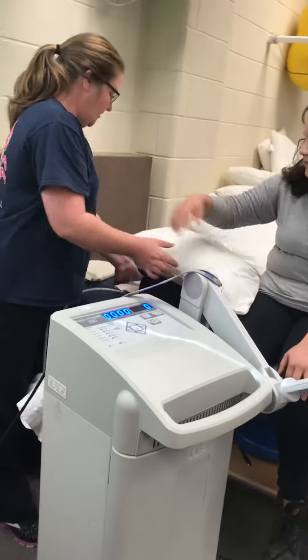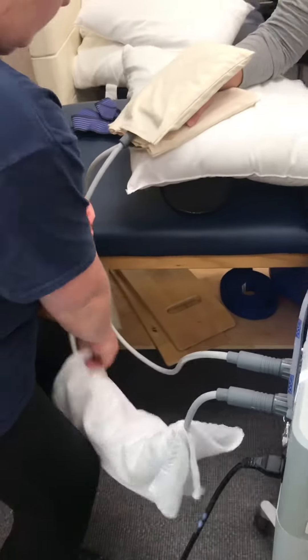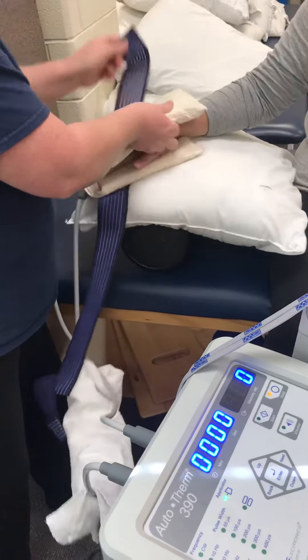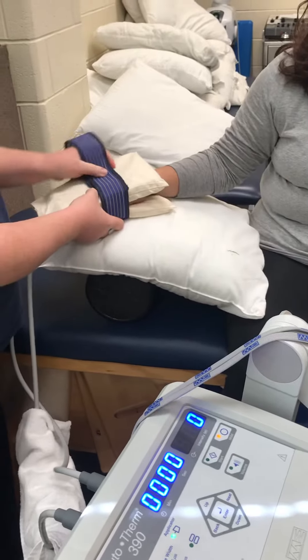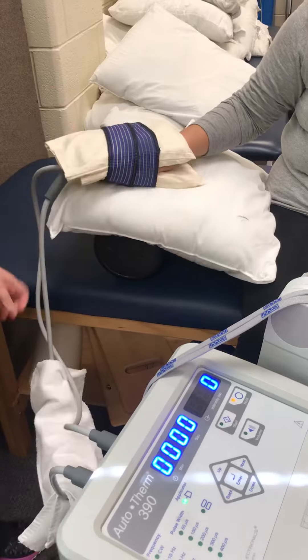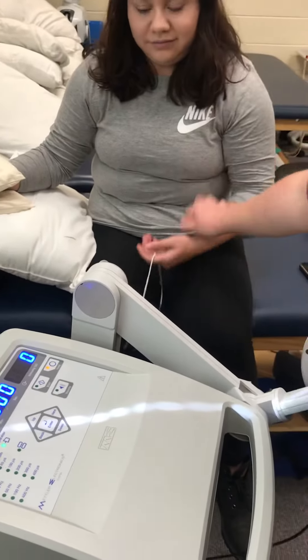Get this on here. You just put your hand up on the pillow. There's wires to touch. Is it just strapped in? Okay, I'm going to give you the call bell. If it gets too hot or anything, you can just pull this and it'll turn it off.